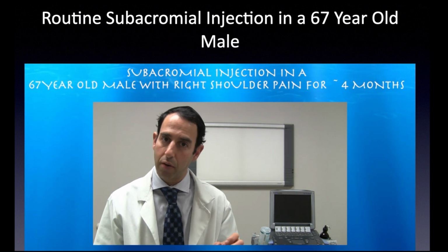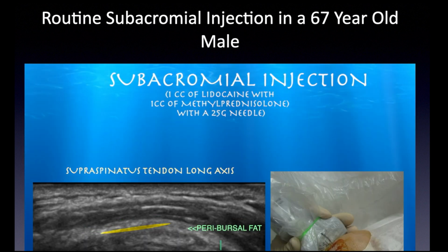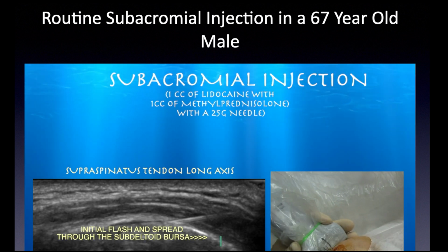And just one other thing about this procedure, I'm just going to jump all the way to the procedure. I'm not going to go into the diagnostic part. Whenever you do injections, at least in the beginning, or even when you're more experienced, you want to have a sterile prep, because look how close the probe is to the needle. It's basically touching the needle. Or sometimes it does touch the needle. So you don't want to not cover your probe. You'll find a lot of people don't cover the probe. They say it's not a big deal.